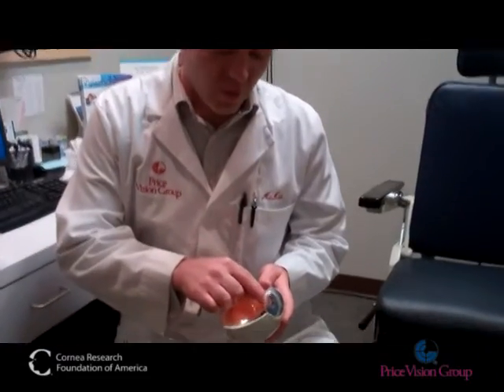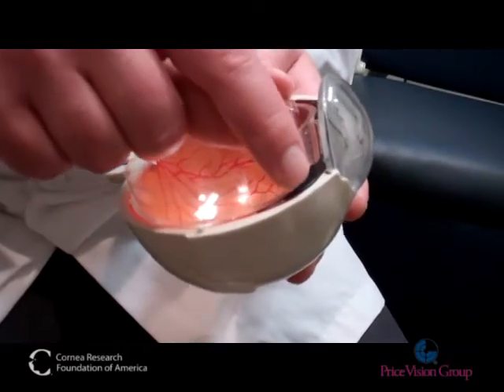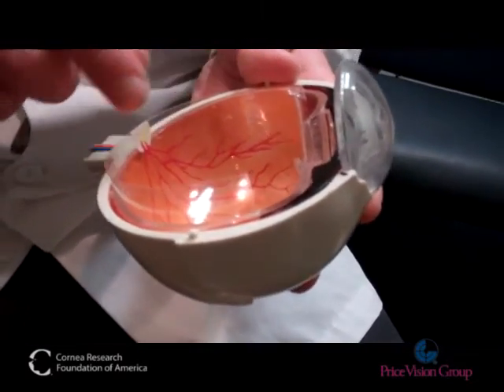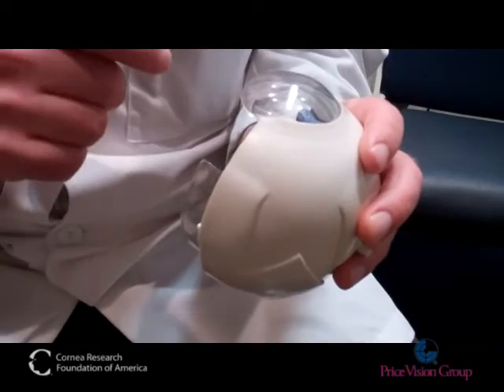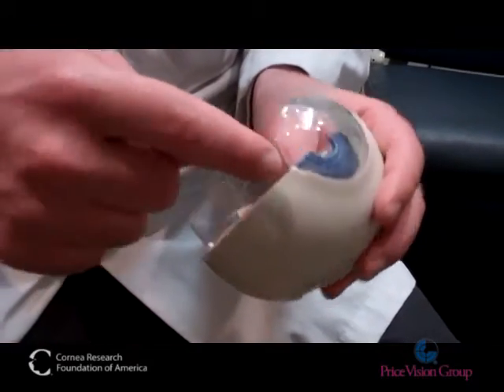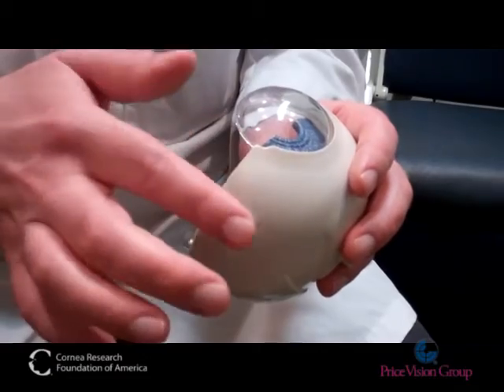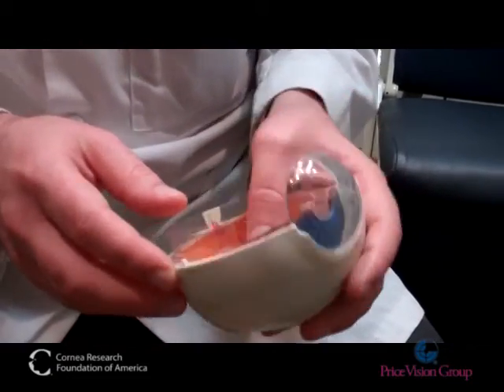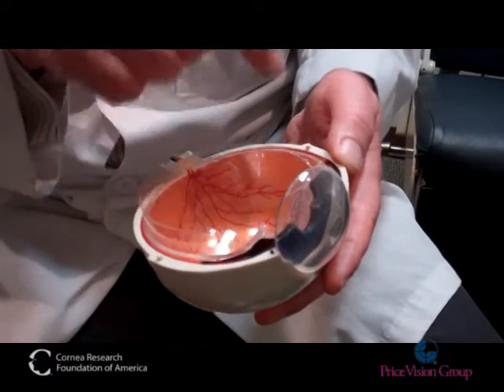The new technique we're using now is something called a glued IOL. This is basically taking a lens that would normally go in the posterior chamber and using the soft flexible arms called haptics, and sticking the haptics into the white part or the sclera of the eye. We do this by making a small incision on the white part, raising a small flap, and then making a tunnel inside the sclera. We pull the haptics — the small plastic arms of the lens — through the white part of the eye and tuck them into the tunnel. Using a fibrin glue we close the flap on top of the sclera and then close the membranes around the eye called the conjunctiva. This results in a very stable, secure, and well-positioned lens where it should be, even if the capsule is not in place.